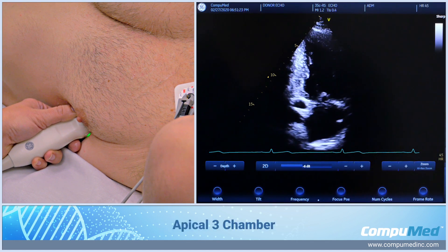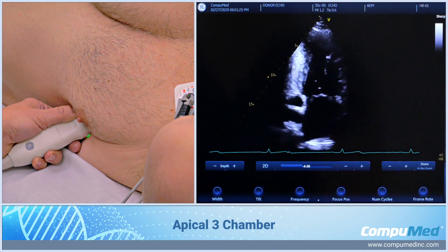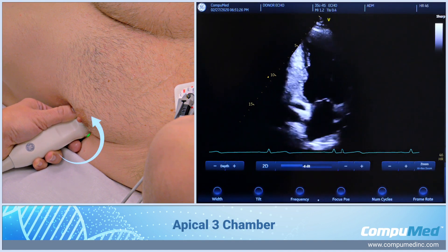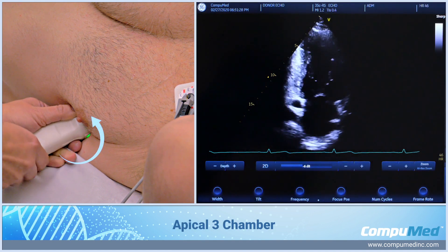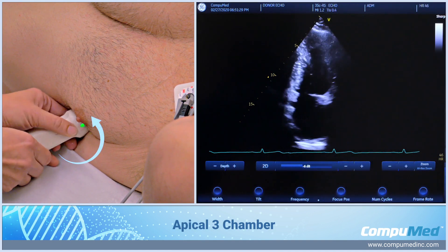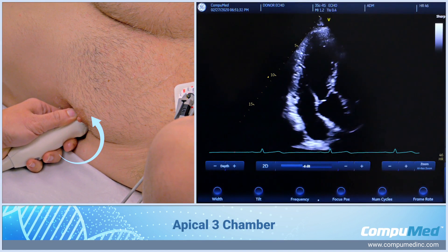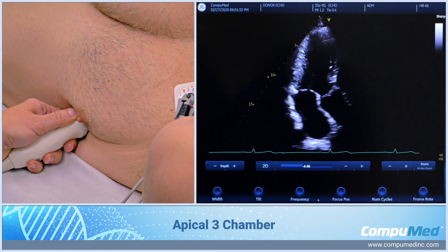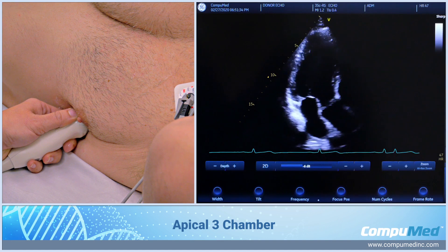From here, to get to an apical 3-chamber, I'm going to keep rotating my transducer counterclockwise towards 11 o'clock. And now I have an apical 3-chamber.